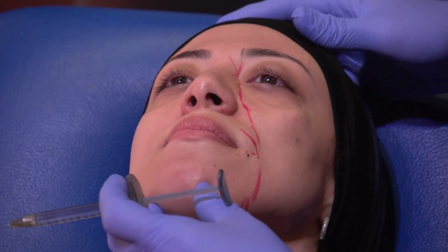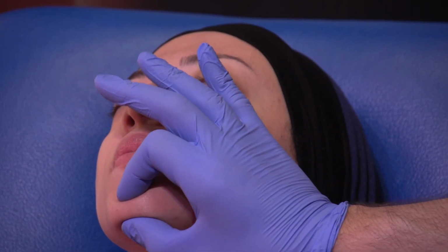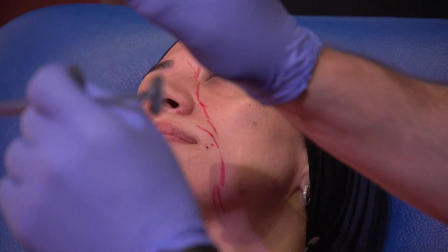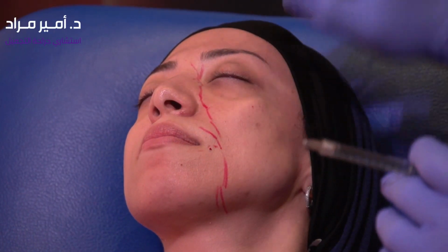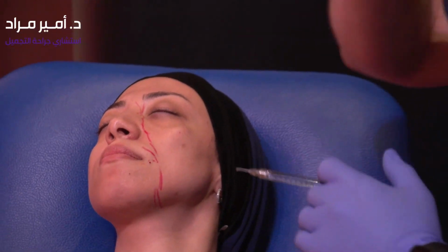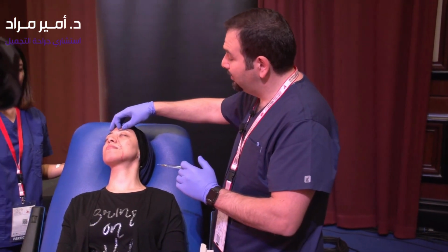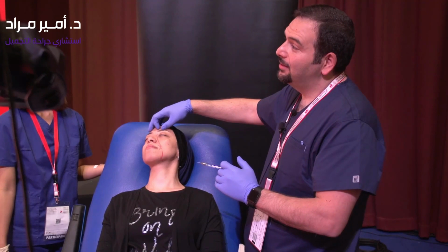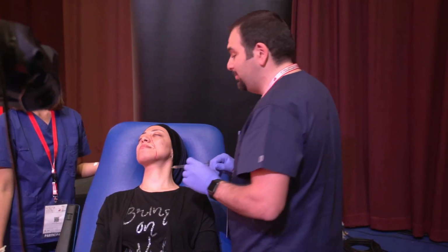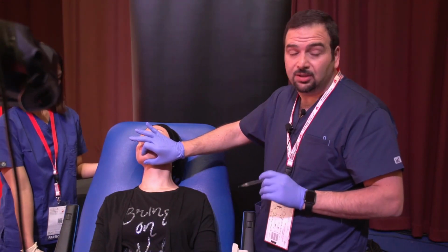So I'll tilt the patient a little bit so you can see the needle. Okay, so I pinch the area. I always pinch, whether Botox or fillers. I think it makes it more comfortable to the patient where you're not dragging the skin and pushing the skin. I sometimes see videos of other doctors injecting with one hand and trying to do something else with the other hand, whether pressure on the patient or using these vibrators. Yes, nerve distractors. I can't see me doing that in my practice because I always, as you've seen here, hold the area, and that will not cause dragging and will cause less pain to your patients. Much less painful.